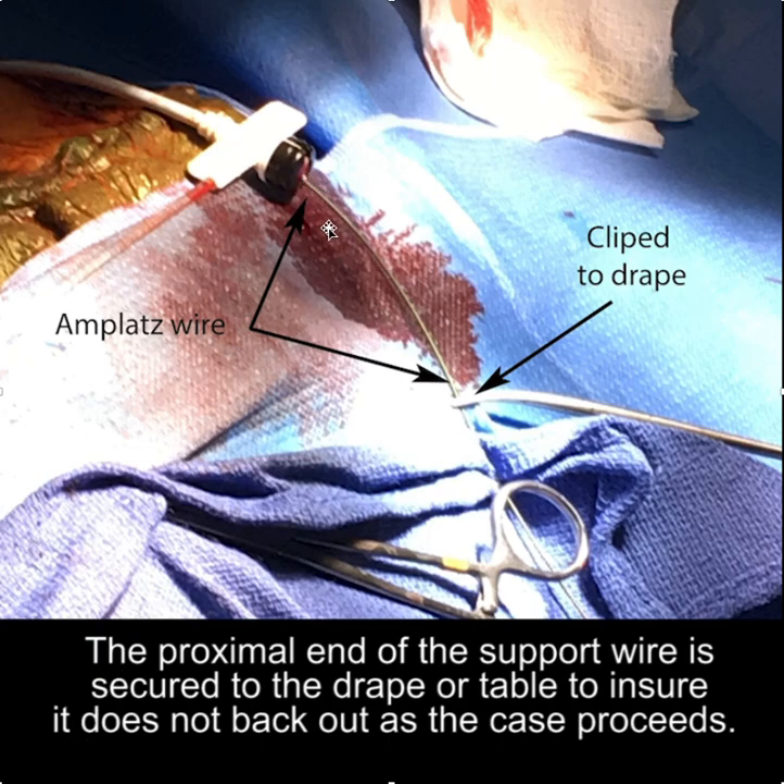Now that you have managed to get the AMPLAT wire in, you don't want it sliding out while you're working. You can either clip the AMPLAT wire to the drape, as illustrated here, or clip it to the table when you have a table at the same height placed perpendicular — either approach stabilizes the wire.